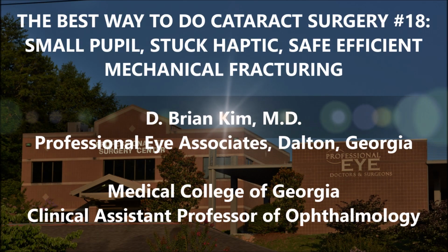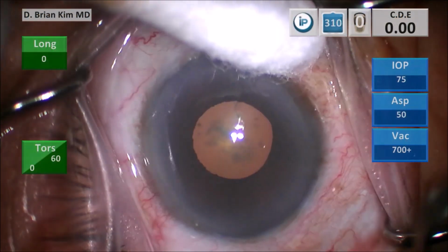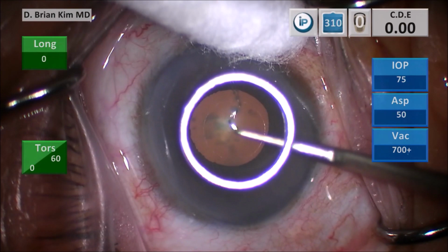I'm going to share with you case number 18 in the best way to do cataract surgery series. This is a small pupil, and I'm going to show mechanical fracturing and how I do it safely without worrying about snagging the capsular bag. And then there's also a stuck haptic, and I'll show you how I'm able to release that stuck haptic from the optic. I use a corneal marker to help me center and size my rhexis.